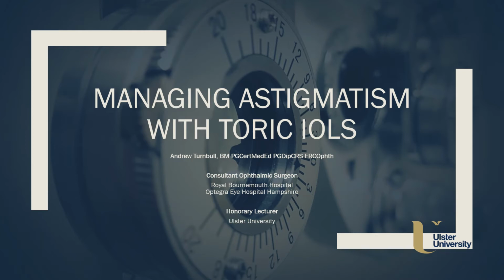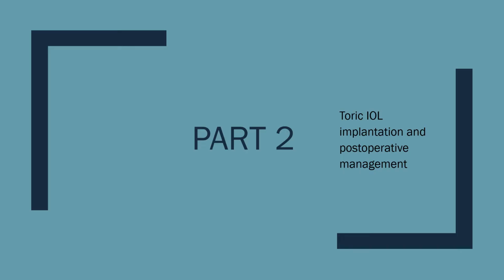Hi, this is Andy Turnbull from the Royal Bournemouth Hospital and Optegra, and welcome to part 2 of this lecture on managing astigmatism with toric IOLs. So in this part we'll cover toric implantation and the postoperative management.